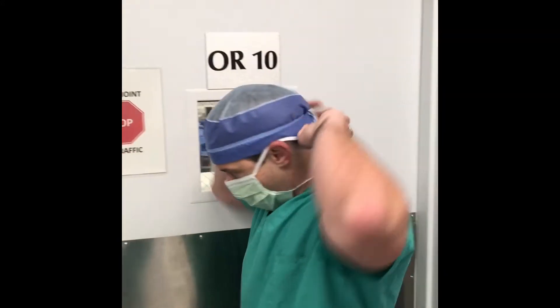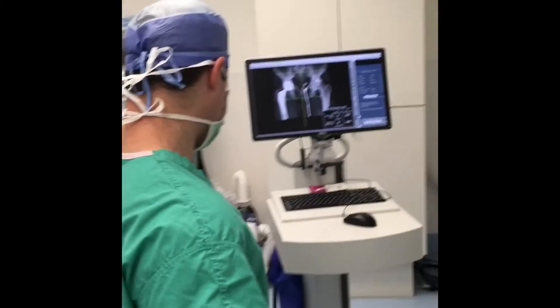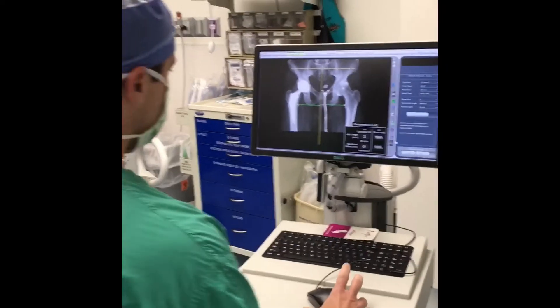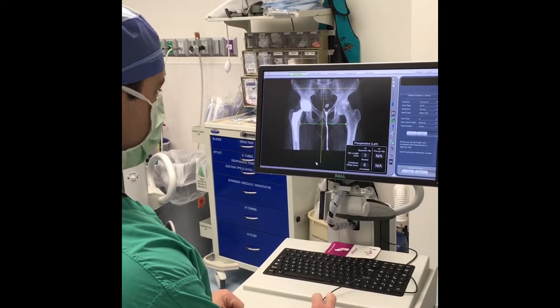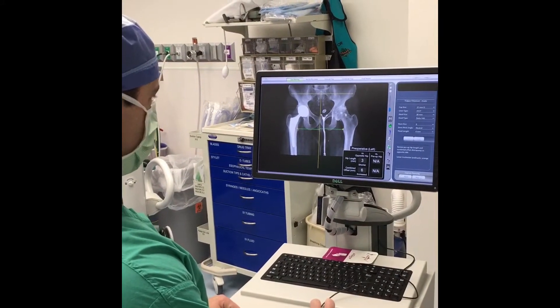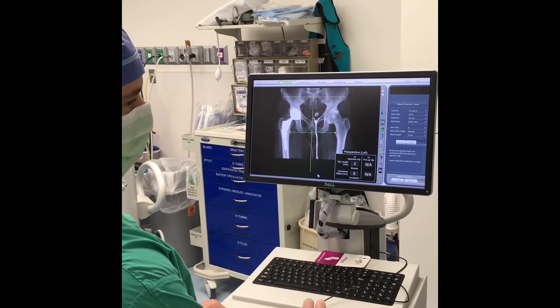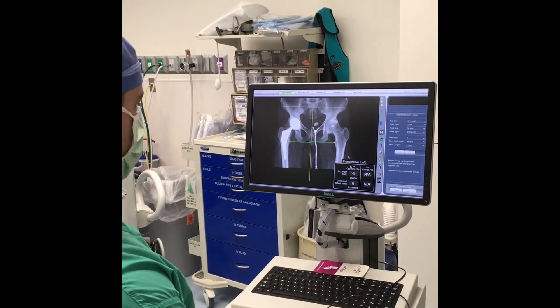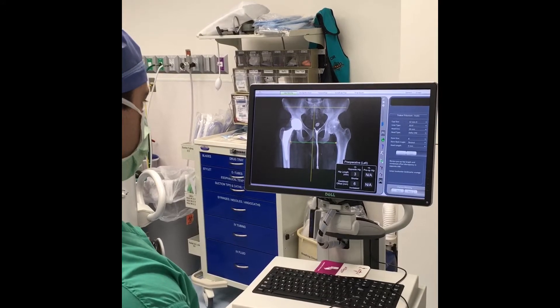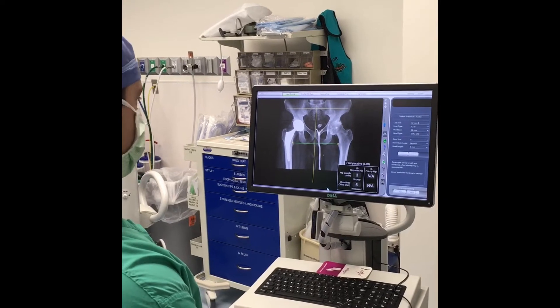We're going to step into the OR and go over our preoperative plan. This gentleman already has a hip replacement on the right side that we did a few months ago. He has a very arthritic hip on the left with a lot of bone spurs. Because we have a CT scan, we know that he is actually three millimeters shorter on the side we're operating on today, and we'll attempt to correct that.